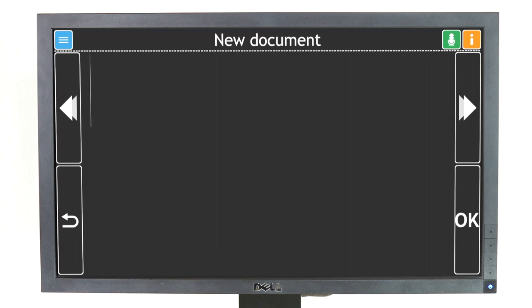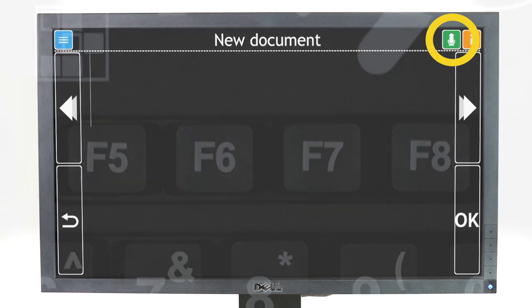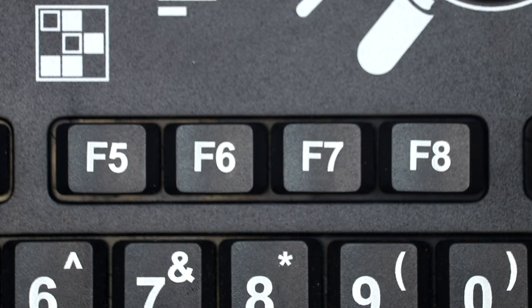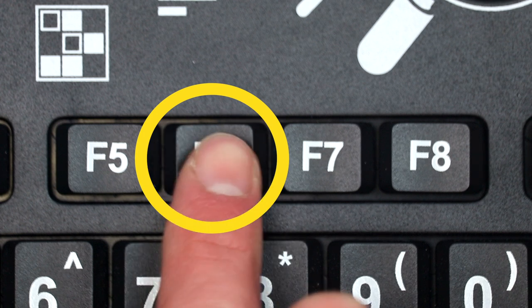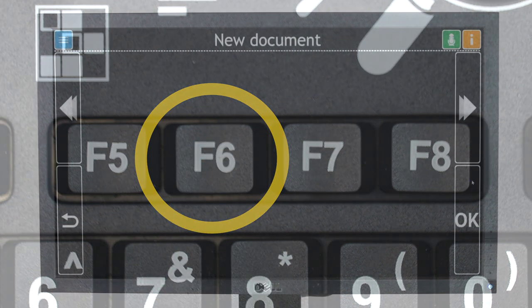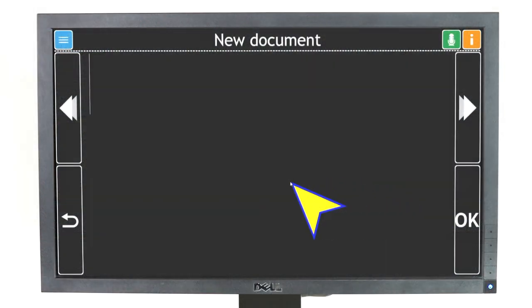GuideConnect will tell you when Voice Input is available and a green speaker button will appear near the top right of the screen, next to the yellow help button. If you're using a keyboard and mouse, press F6 on your keyboard or click the Voice Input button with your mouse to begin speaking.